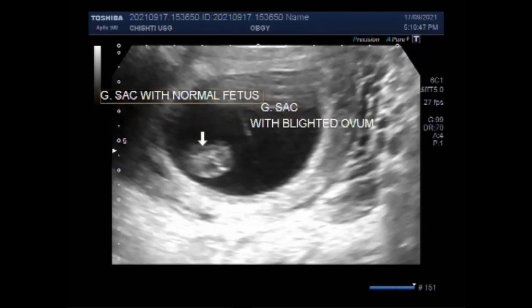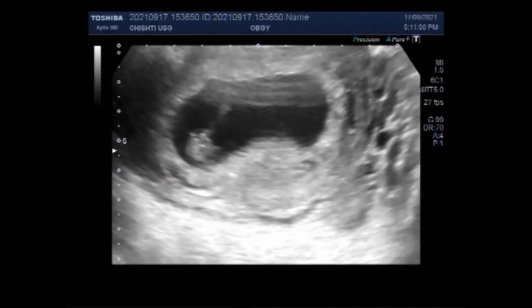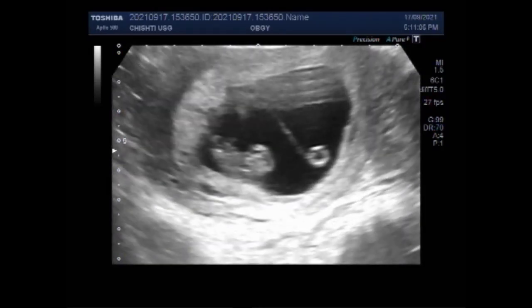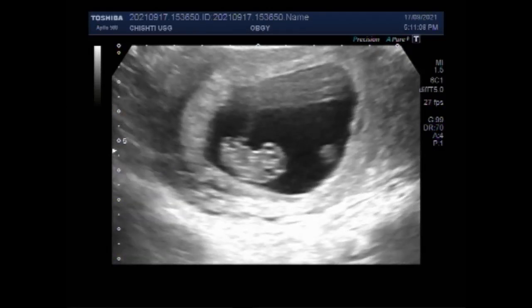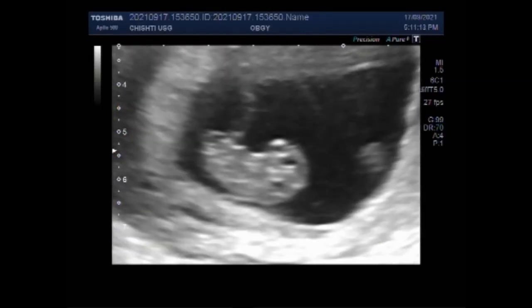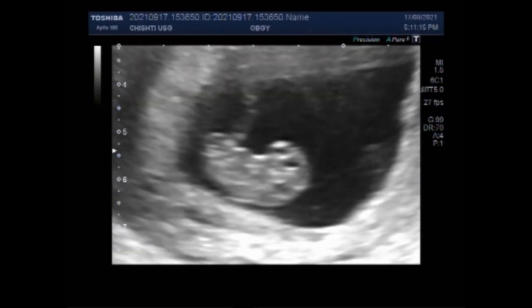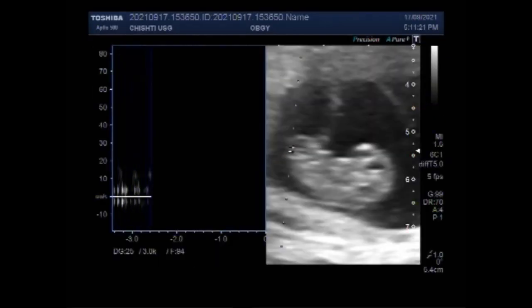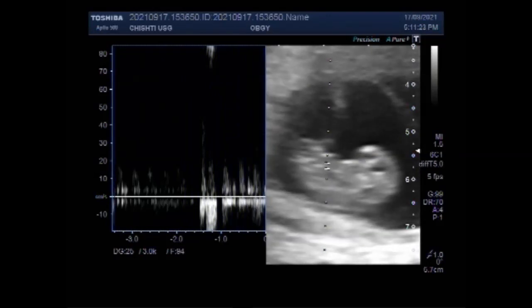The intertwin membrane, as you can see in this case, is clearly visible. It refers to the membranous separation between two fetuses in a twin pregnancy, depending on the chorionicity and amnionicity. The membranes may have a number of layers: di-chorionic, di-amniotic, that is DCDA pregnancy, composed of two chorions and two amniotic layers. Now you can see the echo-normal fetus having fetal cardiac activity.